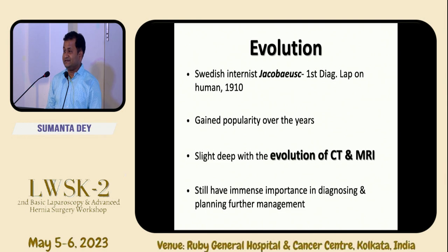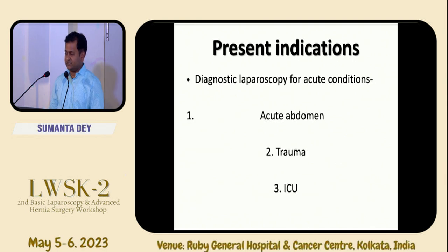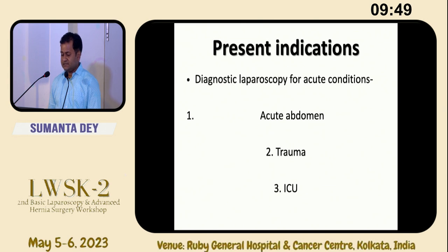What are the present indications of doing diagnostic laparoscopy? I think all laparoscopic surgeons should know how to do a proper diagnostic laparoscopy. There are methods of inspecting the abdomen and conditions in which you can do it. In acute conditions, like acute abdomen, abdominal trauma, or even in very sick patients admitted in the ICU where you suspect some abdominal pathology for the sickness.